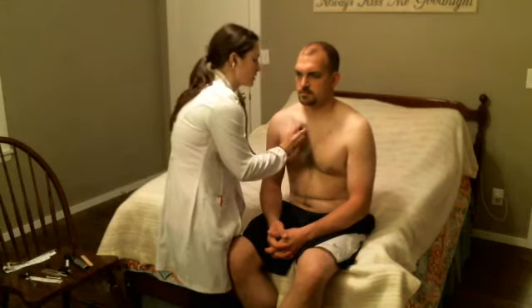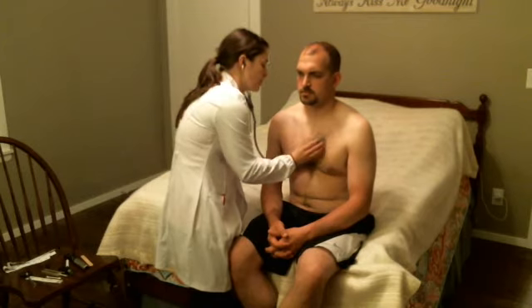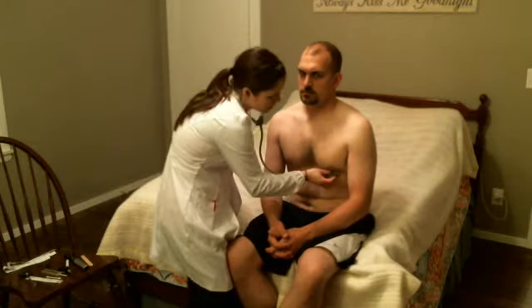Then I'm going to listen to his heart sounds, his aortic, his pulmonic, his Erb's point, his tricuspid, and his mitral.